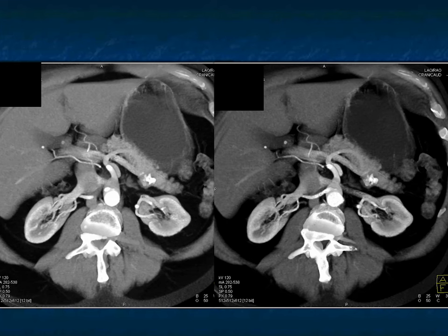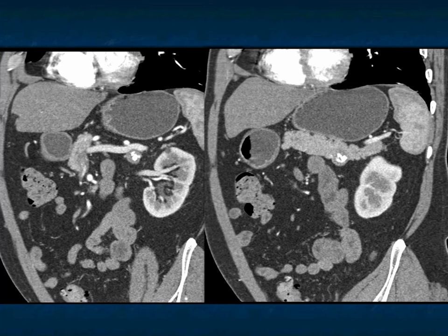One could argue that if it were a neuroendocrine tumor at about 2 cm, it could potentially be followed rather than resected. A few more views of that lesion, nicely shown on 3D mapping, reveal it's interestingly in the periphery of the gland — which is also a bit atypical for a SPEN tumor. Really nice images illustrating that.